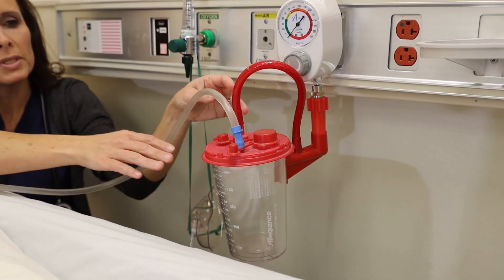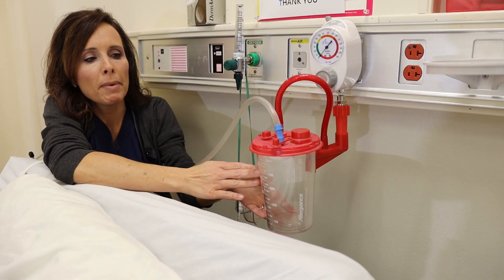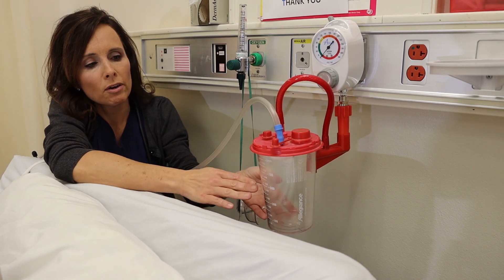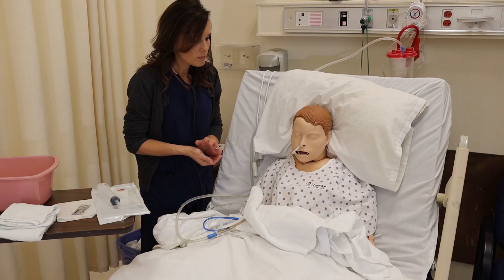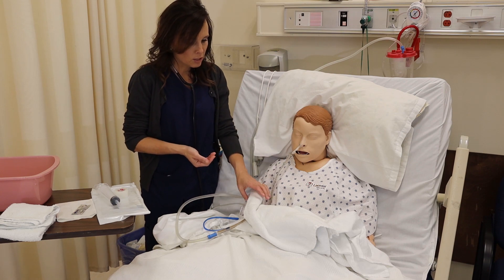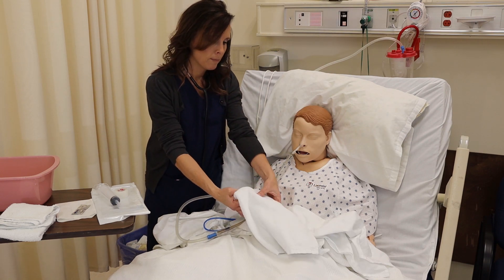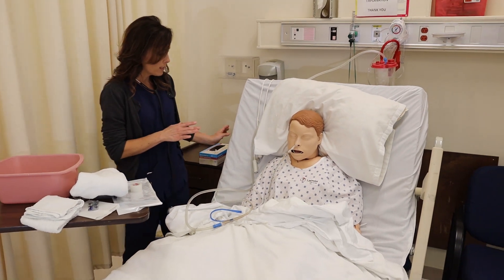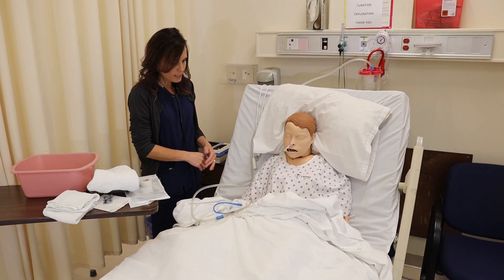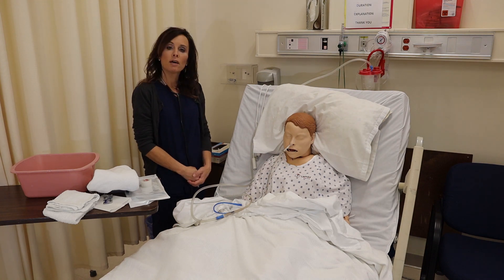Once the NG tube is in place, you're going to want to note the color and the amount of the secretions being removed from the patient's stomach. Check on your patient and make sure they're doing okay. Start cleaning up your supplies, raise the side rail, put the patient back down to a safe level, and document your procedure.